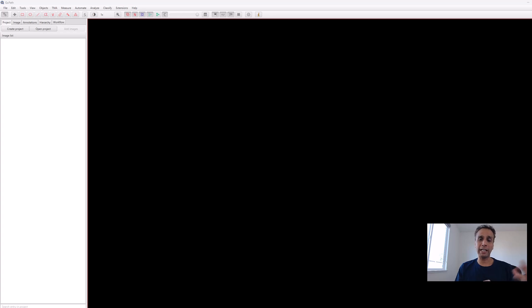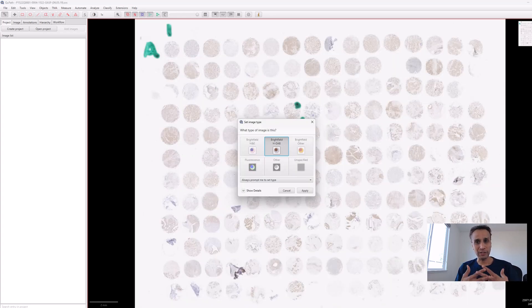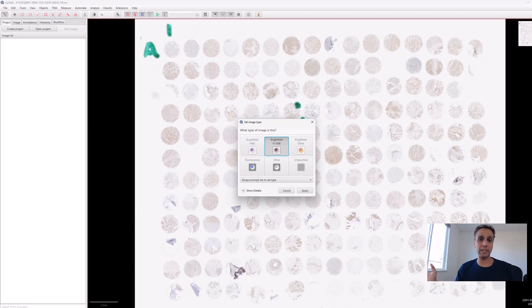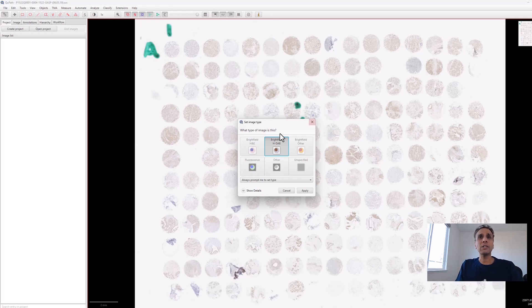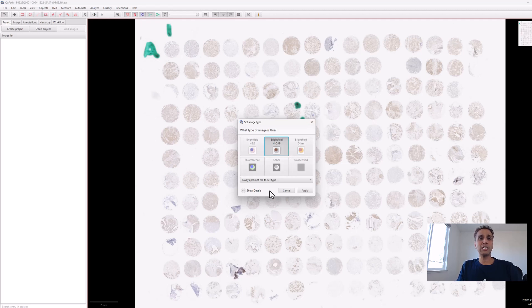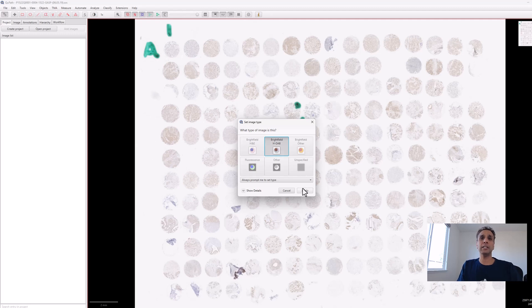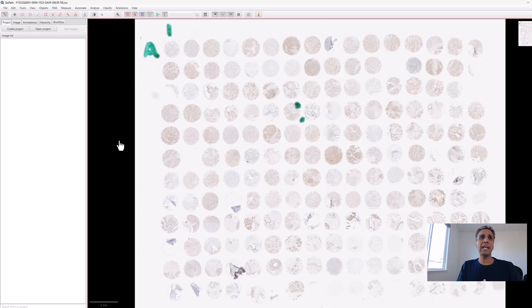SVS is collected on an Aperio system, a compressed file with multiple levels of information stored in a pyramid structure. Level zero is your highest resolution image, level one is slightly lower, level two is lower, and so on. Let's go ahead and apply. The image is ready for analysis.